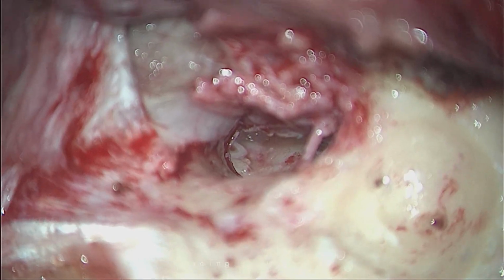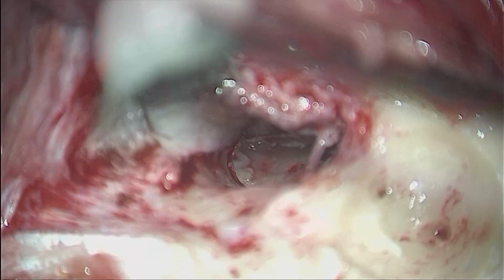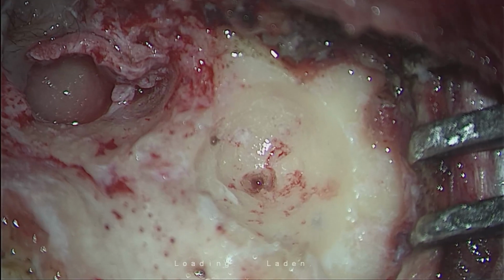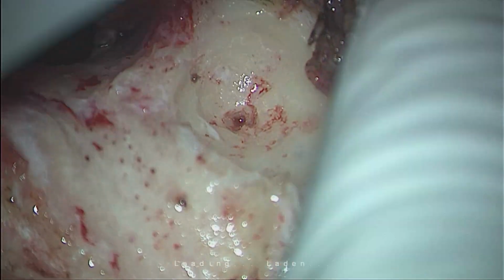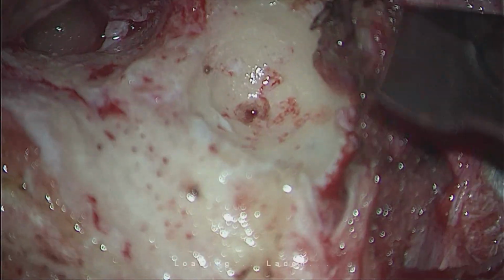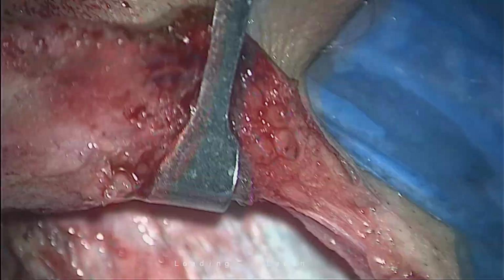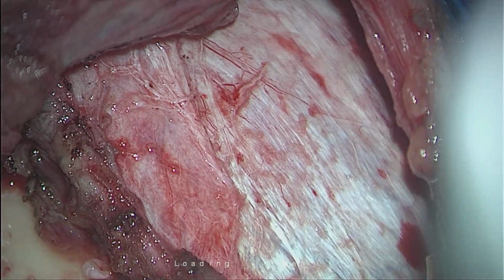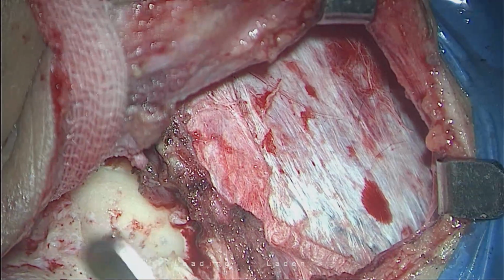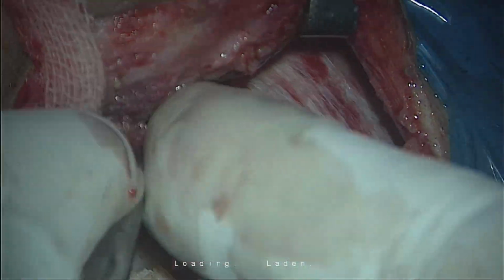Cotton ball. So now, for the graft, we have not harvested the graft yet. We now believe in fresh grafting, or what I call bed-to-bed grafting, which I am going to show you. I don't want to damage the fibroblasts of the temporalis fascia, to make it as atraumatic as possible. Though we have seen the grafts do take up even if you dry them by any means, by lamp or anything, still they work, because most of the time they act as a scaffold. But in any given situation, this fresh graft cannot be inferior to that. Rather than going into discussion whether it is needed or not, I would say it is never inferior. What we have found in our practice is that the healing is much faster than with the dry graft.